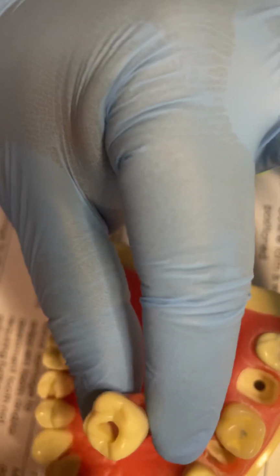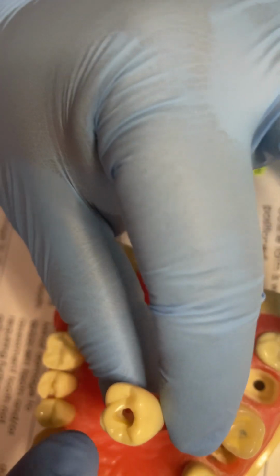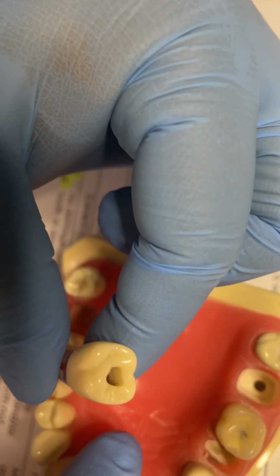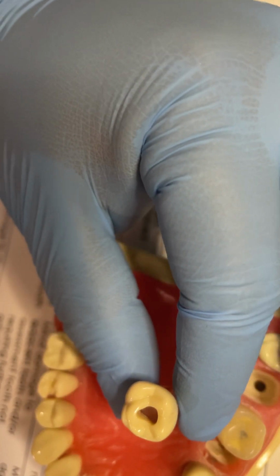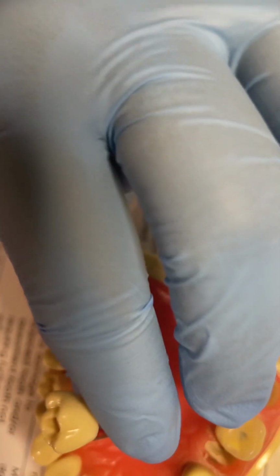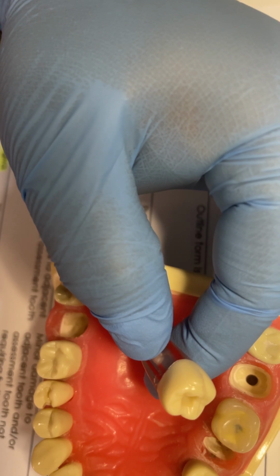The exam tooth is a bit smaller in size. The pulp chamber is small, and the color inside is also different, it's whitish, and the texture is also softer. And the shape of the access cavity is different as well.